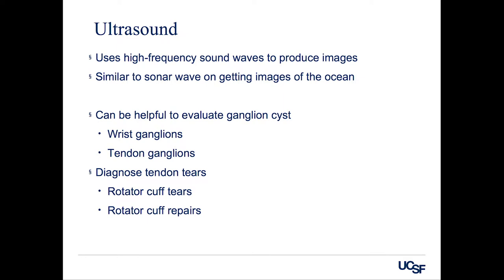And then in the shoulder, nowadays people are using this more and more to diagnose rotator cuff tears. So this is a relatively minimally invasive modality where you could do it in the office just over the skin, and then you can see, for a well-trained technician, whether there is actually discontinuity of the tear. And then after surgery, it's very good for evaluating how well the tendon is healing, because if you have implants in there, that can affect the way a post-op MRI would look or a CT scan, but an ultrasound can actually detect the quality of the tendon in the presence of any other implants.